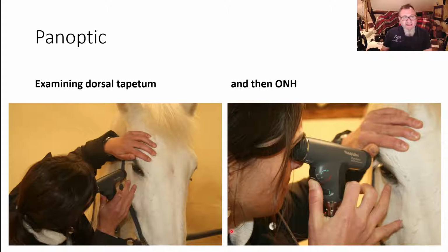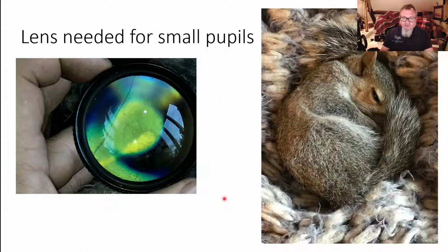At the side, if you've got the Panoptic ophthalmoscope, this is a wonderful instrument. They quite often get bought and popped in the cupboard because people forget how to use them. They're a type of indirect ophthalmoscope. They're much easier to use than the traditional lens, and they can give a very good image of your patient. So if you have one of these instruments, it's definitely worth digging it out of the drawer.